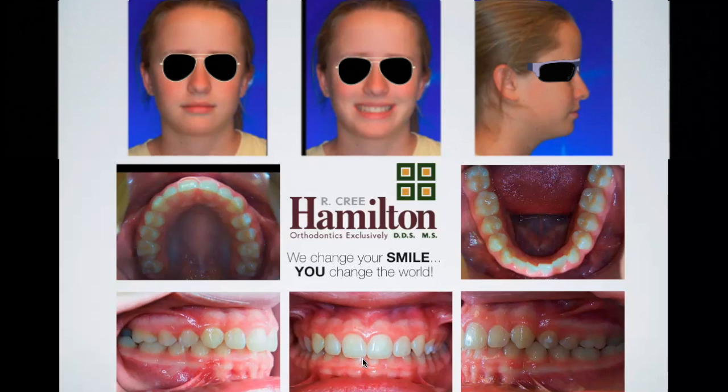But in this case, one of two things happened. Either A, it grew back the other way once the occlusion was corrected, or B, and probably more likely, once we got her off of her own teeth, the jaw just relaxed back into place, and the asymmetric growth had not occurred. So again, most of the time, I would say this does not happen. But this patient got lucky.